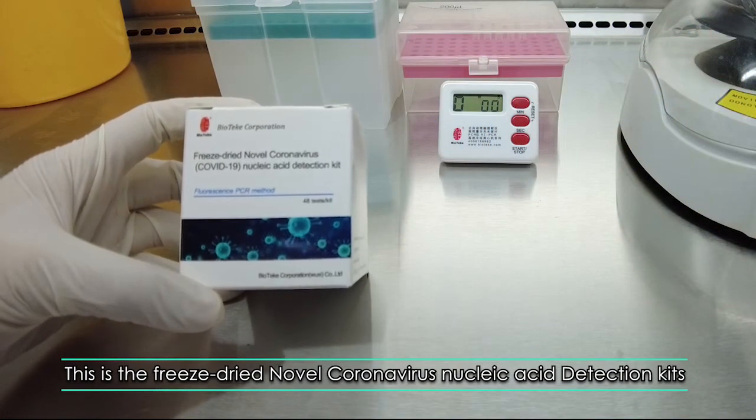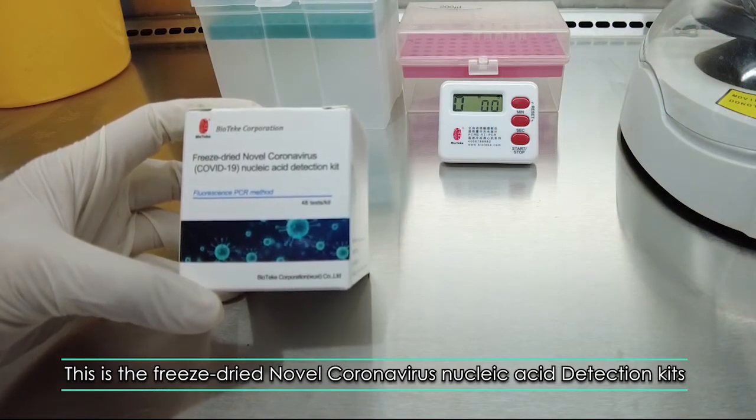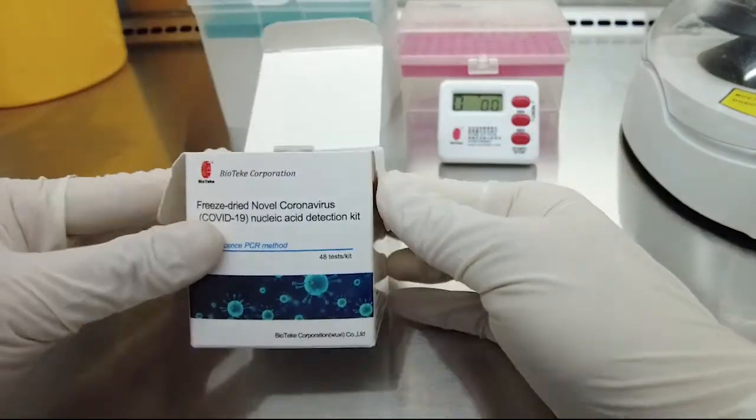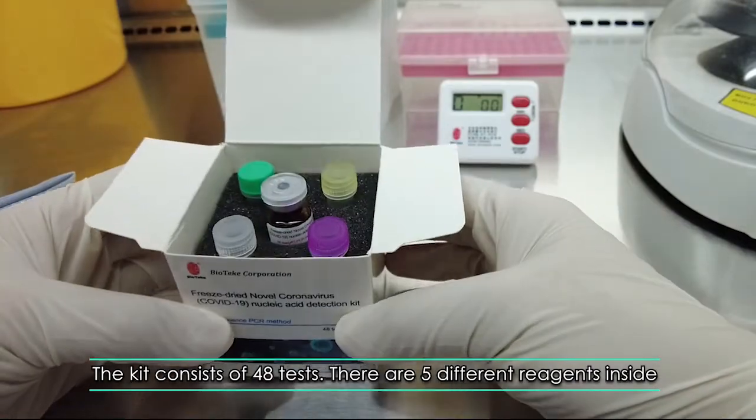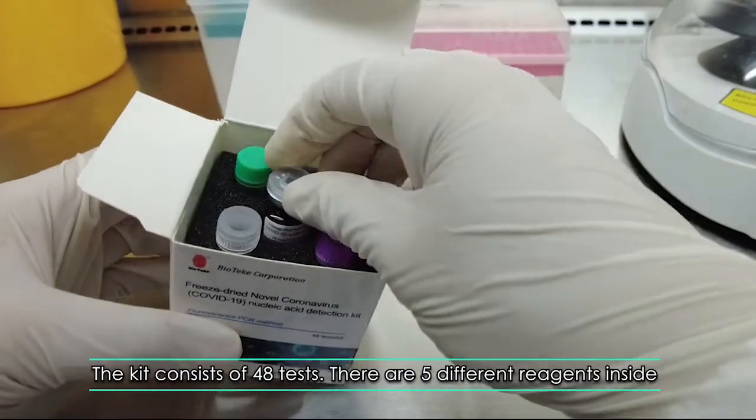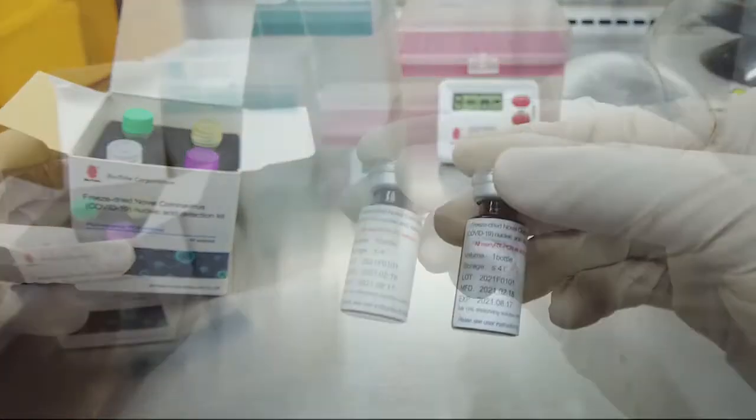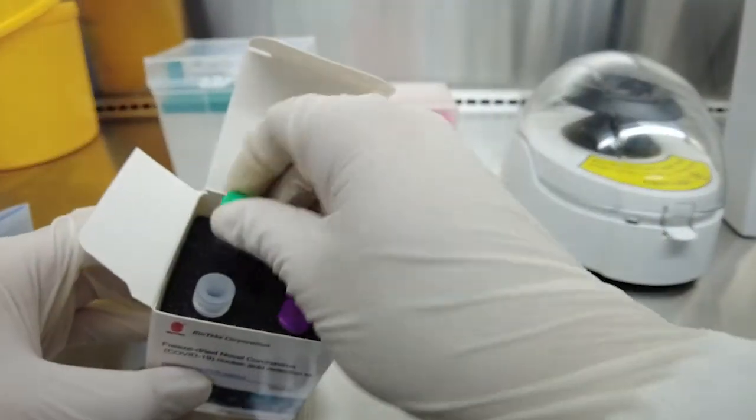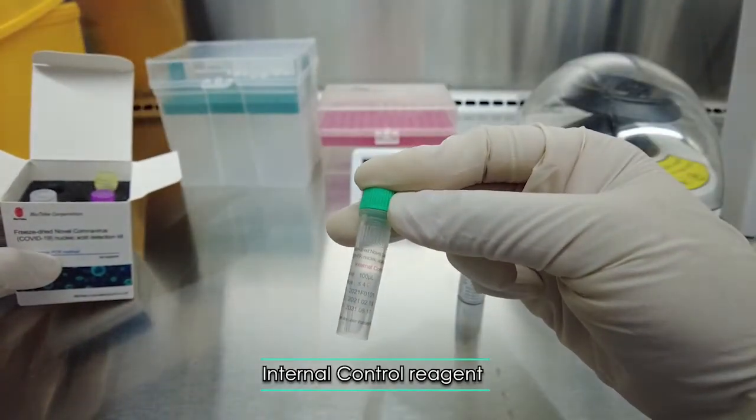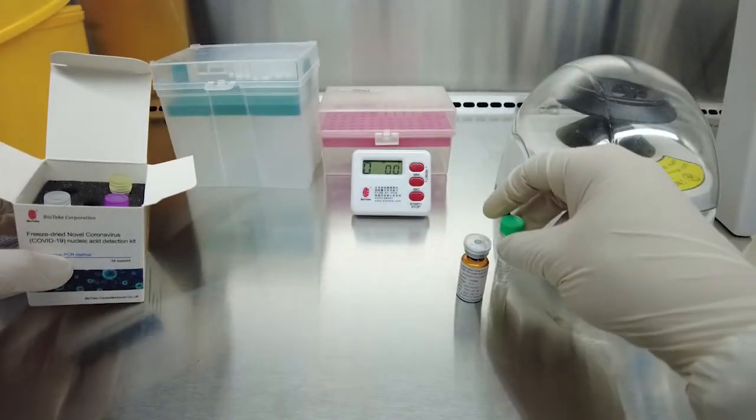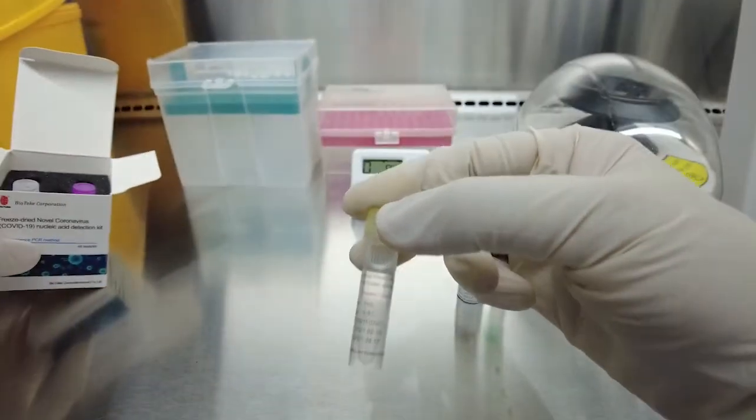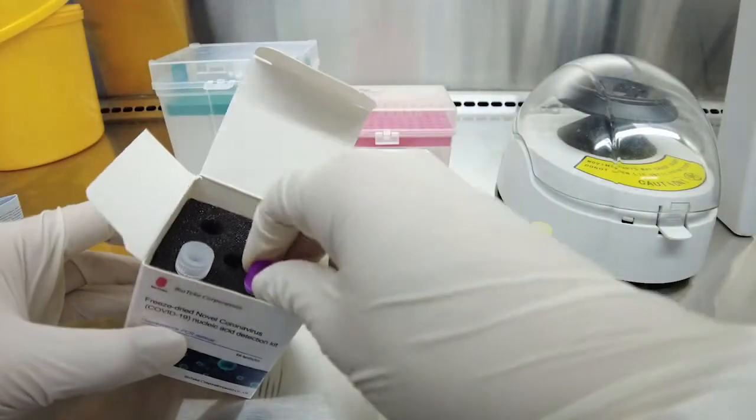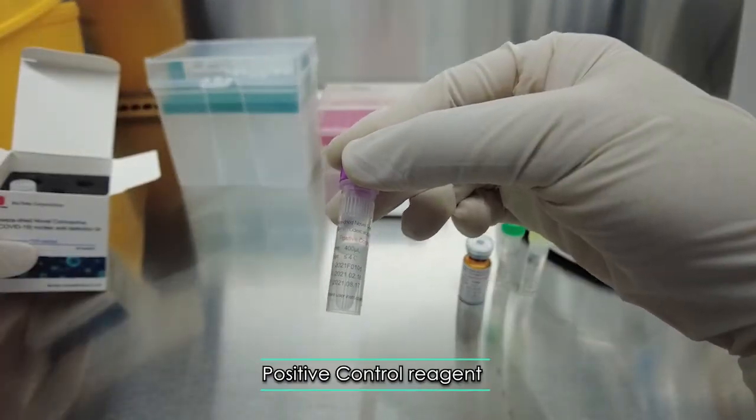This is the freeze-dried novel coronavirus nucleic acid detection kit. The kit consists of 48 tests. There are five different reagents inside: RT-PCR Multipremix Powder, Internal Control Reagent, Negative Control Reagent, Positive Control Reagent.